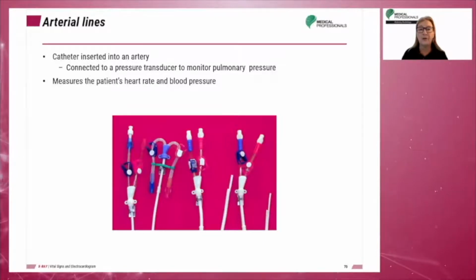With an arterial line in place, the physician will have a continuous measurement of systolic and diastolic pressure and the mean arterial pressure. The lines can be used to deliver saline or blood thinners to prevent clotting. No other medication should be injected into an arterial line.